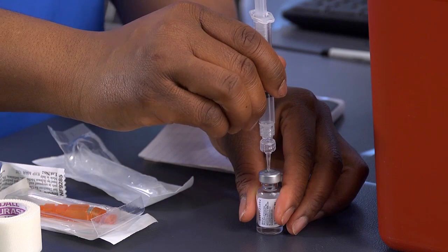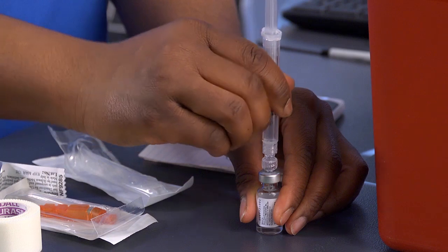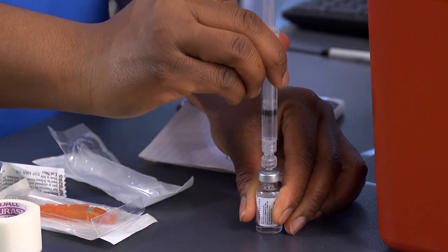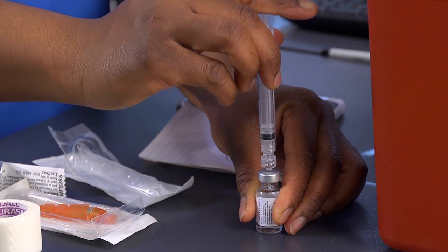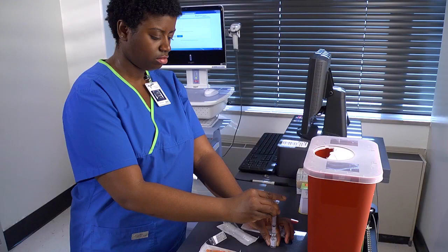Holding the vial on a flat surface, insert the tip of the needle or needleless device through the center of the rubber seal. Inject the air you drew into the syringe into the airspace of the vial. Press firmly on the plunger to overcome the air pressure within. Hold the vial with your non-dominant hand. Hold the syringe and plunger with your dominant hand.